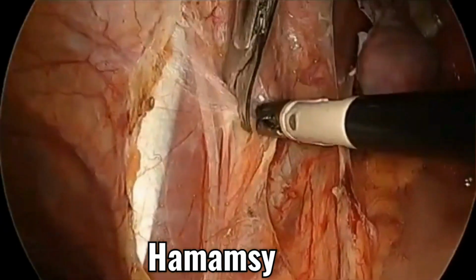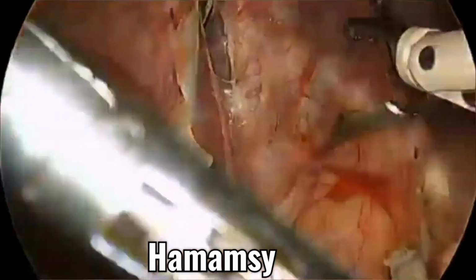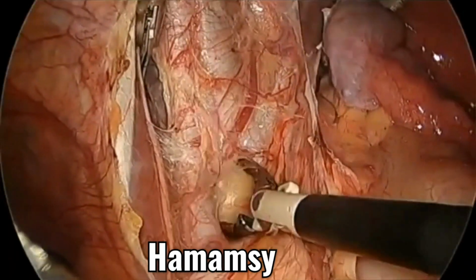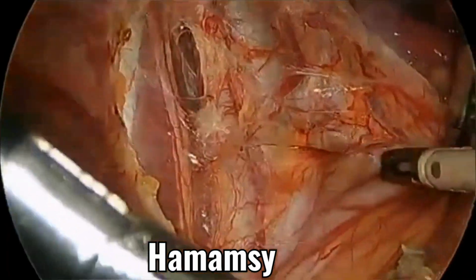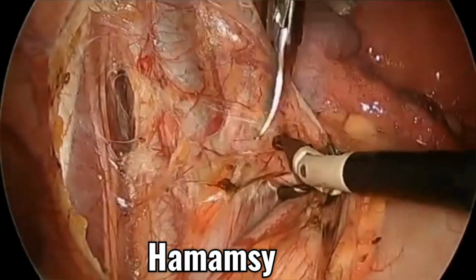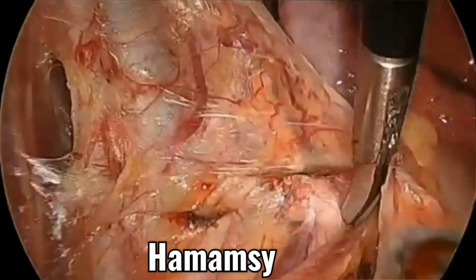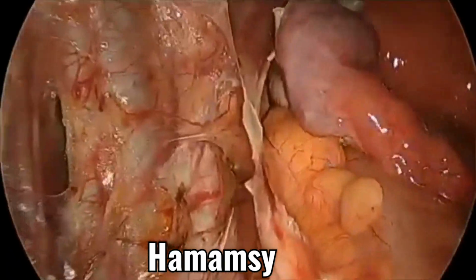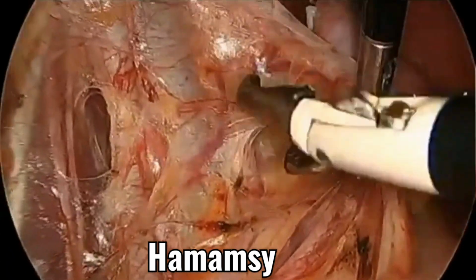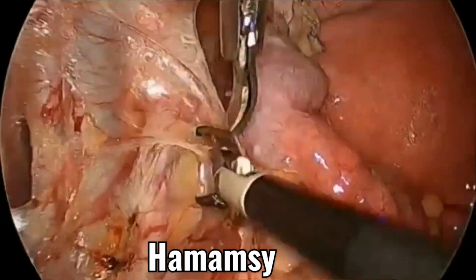Then the iliac vessels. وانا رايح فين؟ انا رايح للgenitofemoral nerve and the boundaries of the psoas muscles. زي ما انت شايف كده انا بفتح الشيس بتاعي using a sweeping manner movement.